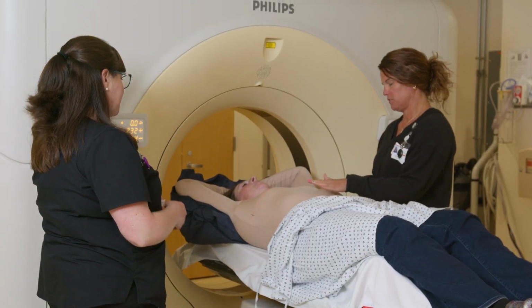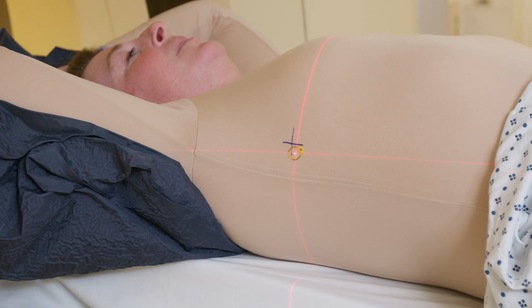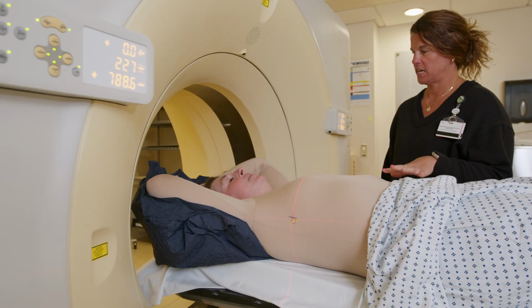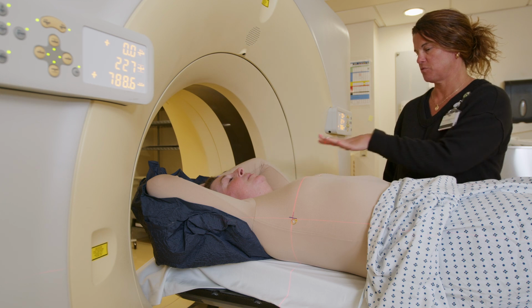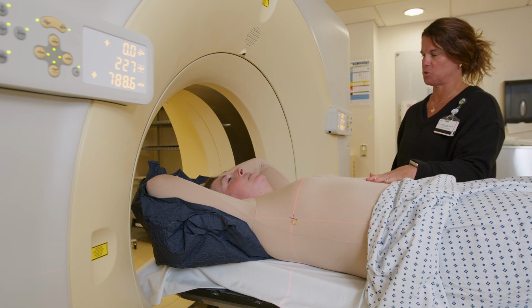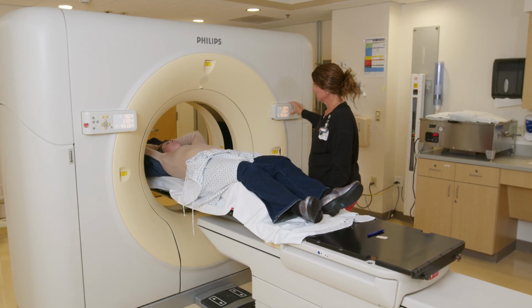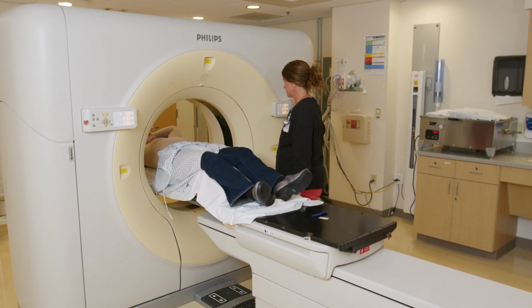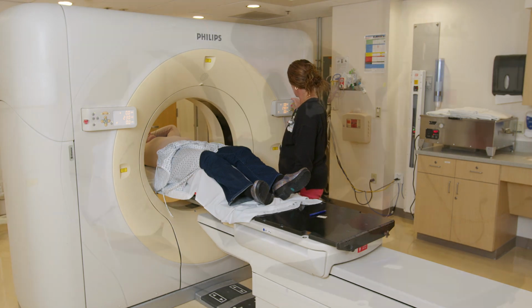After the 30 seconds, we'll instruct you to breathe out through your mouth. Keep holding still between breath holds to maintain your best position. We'll then ask you to repeat the breath hold for a shorter amount of time to check that you can take the same amount of air on each breath. Once you're comfortable with the breath hold, the therapist will start the process to scan you in the treatment position.